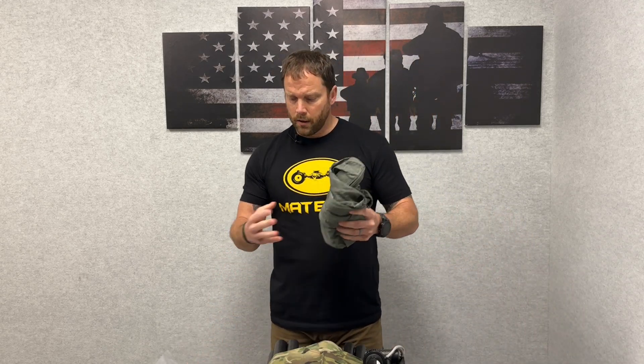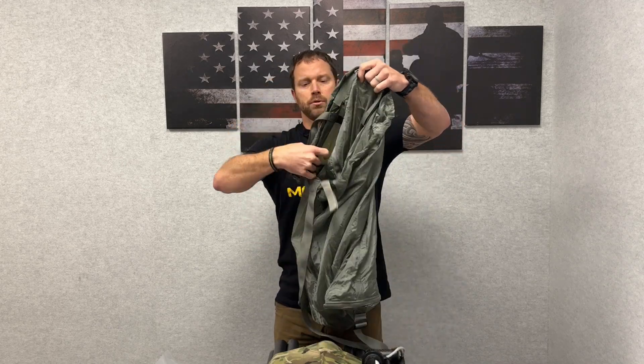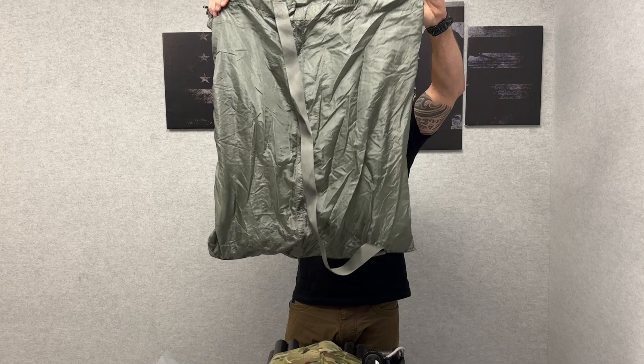It comes vacuum sealed in this configuration and also comes as a bag first. The primary reason was that as we were developing this, we knew that the majority of the time, one of the first things that is left behind is a litter. But what guys do need to carry is a lightweight bag that they can put computers, documents — and if they do take a casualty, they can put the helmet and sensitive items from that down soldier in that bag.